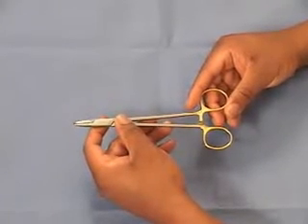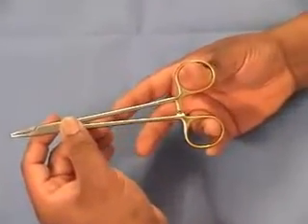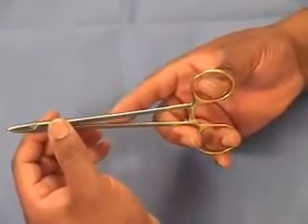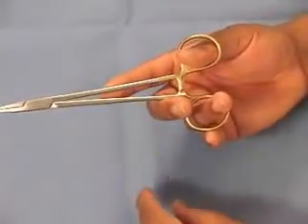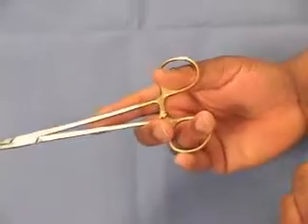First, we'll start with the finger control. The thumb goes in the upper ring, the ring finger goes in the lower ring. The index finger goes on the body or shaft of the needle holder. The middle finger and the pinky can add stability to the lower ring.